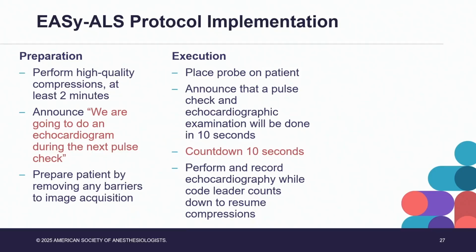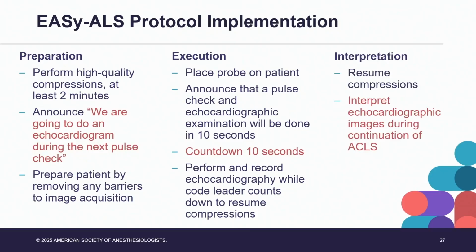We want to perform and record the echocardiography exam while they are counting down, and then immediately resume compressions. And when we're doing it, we want to hit record on our machine so that we can record our images. And then it's recommended that the interpretation of these images be done as CPR is resumed, so that you can focus separately on obtaining the images and then stepping back and actually interpreting from your video that you recorded. So you're going to resume the compressions and then interpret your images during the continuation of ACLS.